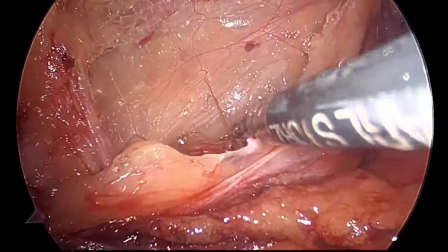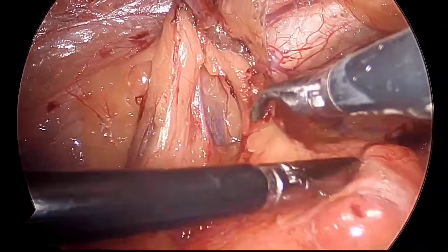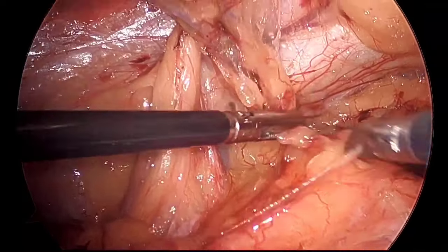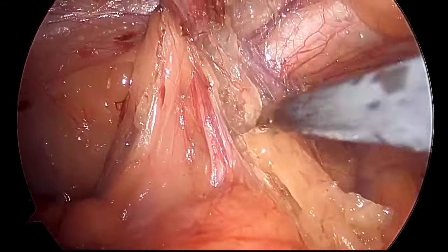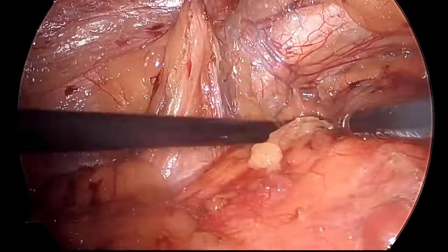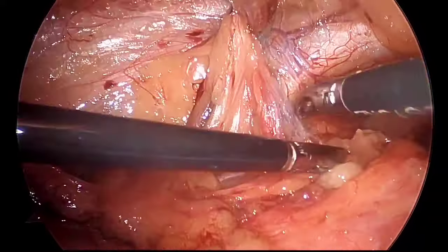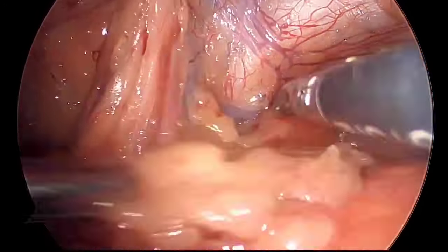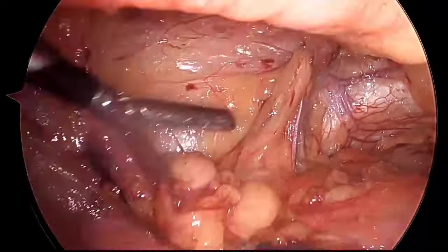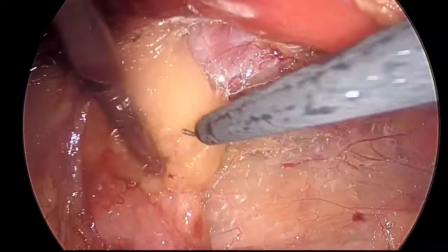Now further dissection proceeded to expose the cord structures and achieve the myopectineal orifice. So you can see further dissection on the medial aspect, the preperitoneal fatty tissue is dissected off. Now medially the vas deferens, laterally the gonadal vessels are getting properly visualized, and beyond that the external iliac vein is also visible. Laterally the fat, which is covering the psoas muscle, and then a lot of important nerves is exposed.